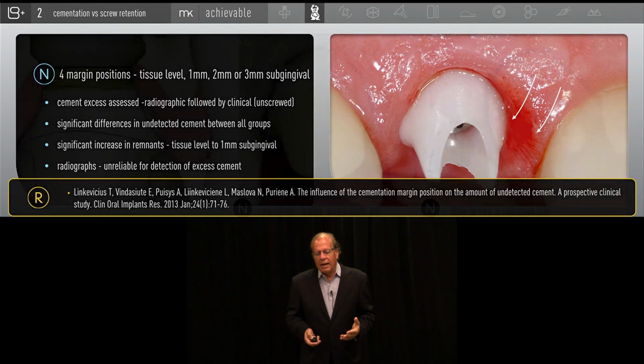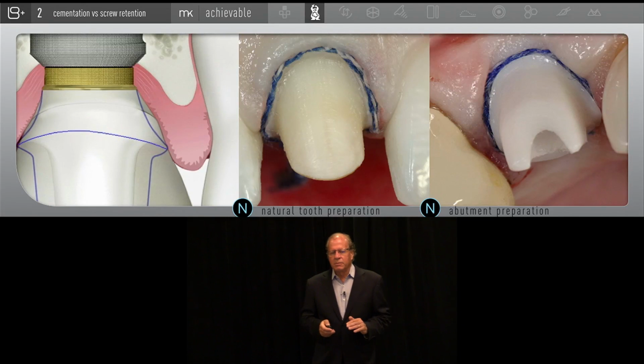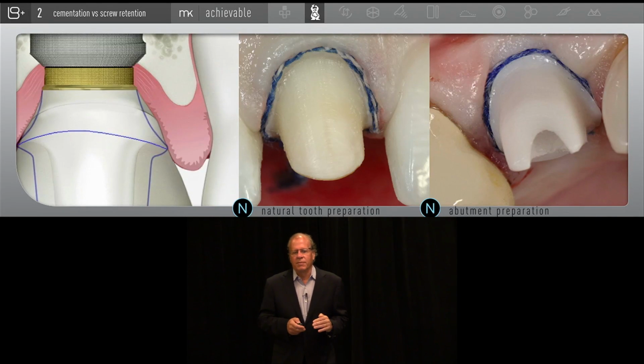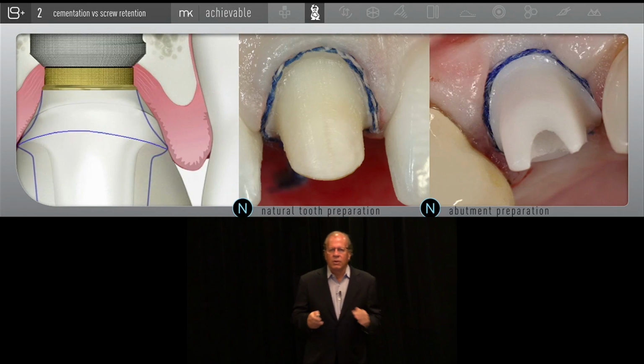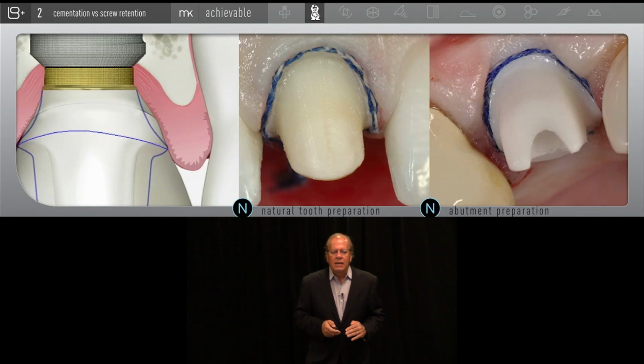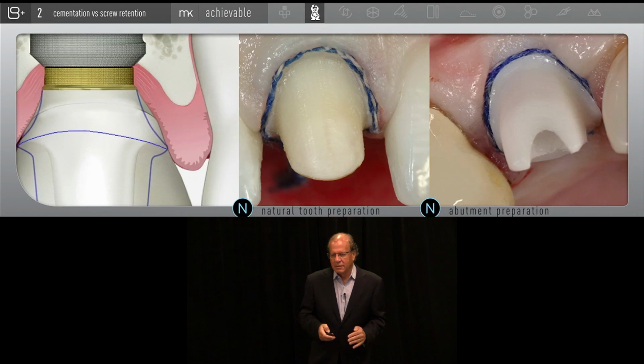So when I'm designing these abutments, I'm looking for the minimal amount of displacement under the tissue. I'm looking at treating my abutment design very much the same way as a natural tooth, which means that we have the rise and fall of the preparation 360 degrees, and we are able to take an excellent quality tissue, which is another part of the program, but for this purpose, we're just talking about design. Place a cord, have that tissue hugging the cord hugging the abutment, and use it as a deflective mechanism for cement.